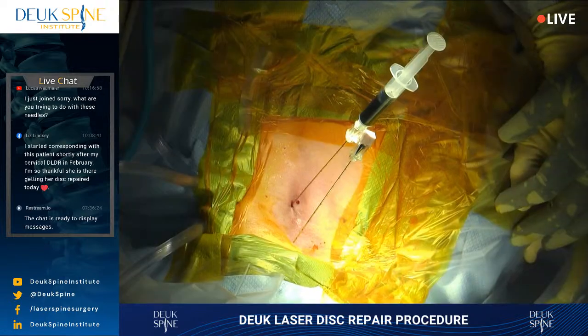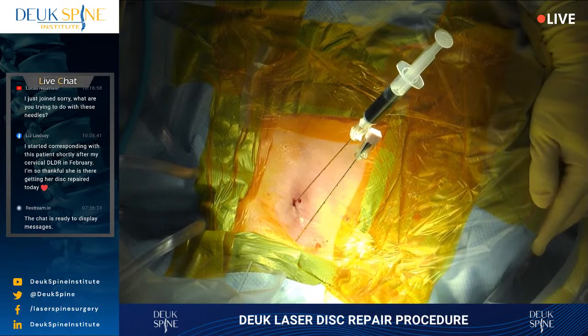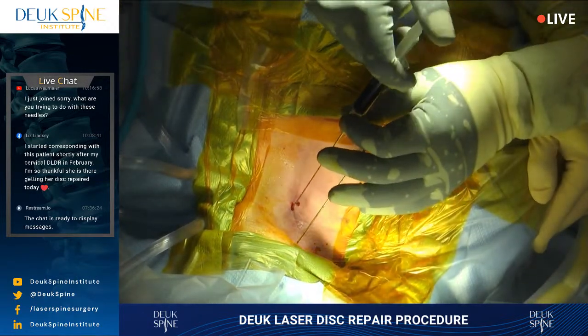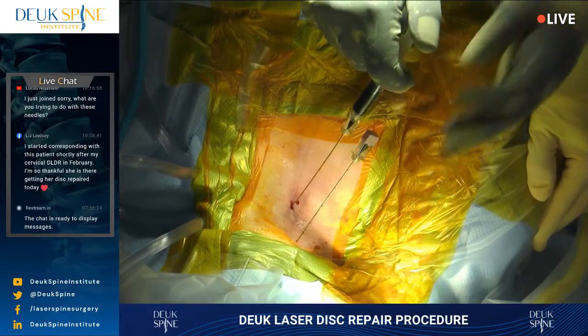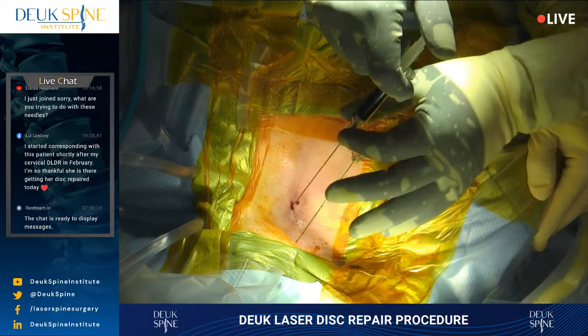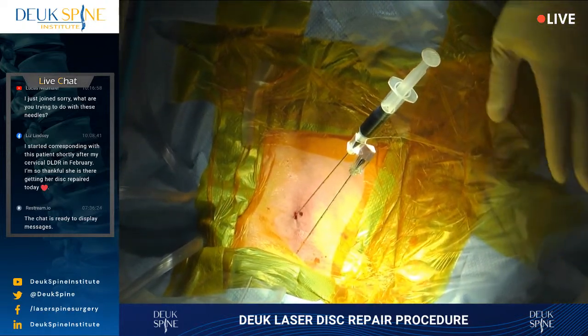Are you getting the head? Shot? Let's see where we are. Is that where we are there? If you can just give me a little head pull. All right. Shot? Good. All right, we got the herniation is stained there. You can see it. All right, good. Relax, everyone. Relax for a moment.